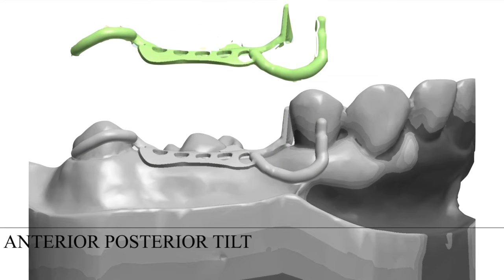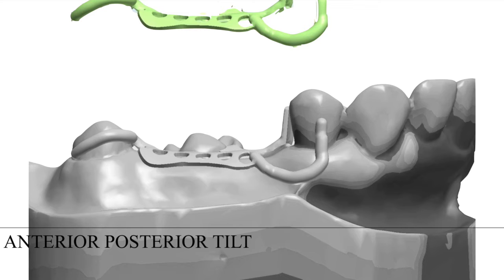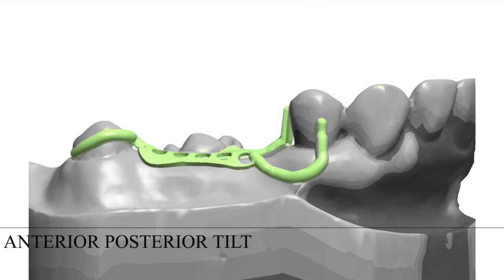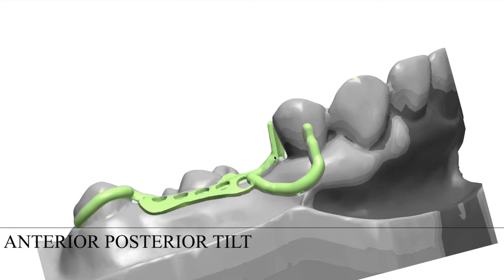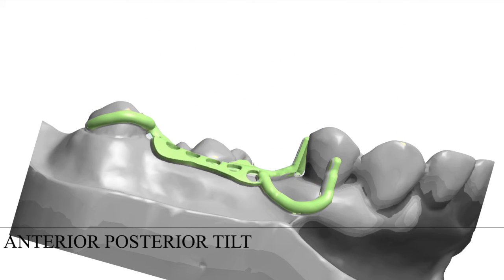When the metal framework is seated or removed, it follows through the path of insertion that we determine. And watch carefully about the amount of undercut, because this portion should be relieved so that the metal framework could be inserted without trouble. When you tilt the cast, the amount of the undercut will change because of the path of insertion change. And when you tilt the opposite way, the undercut amount present on the distal of the abutment is affected.